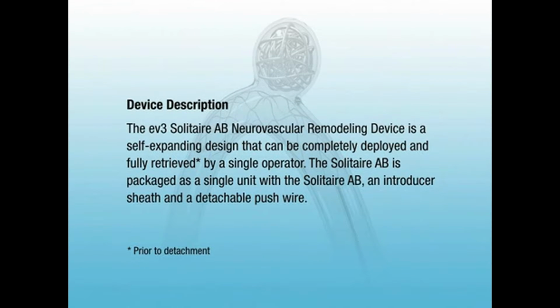The EV3 Solitaire AB neurovascular remodeling device is a self-expanding design that can be completely deployed and fully retrieved by a single operator. The Solitaire AB is packaged as a single unit with the Solitaire AB, an introducer sheath, and a detachable push wire.